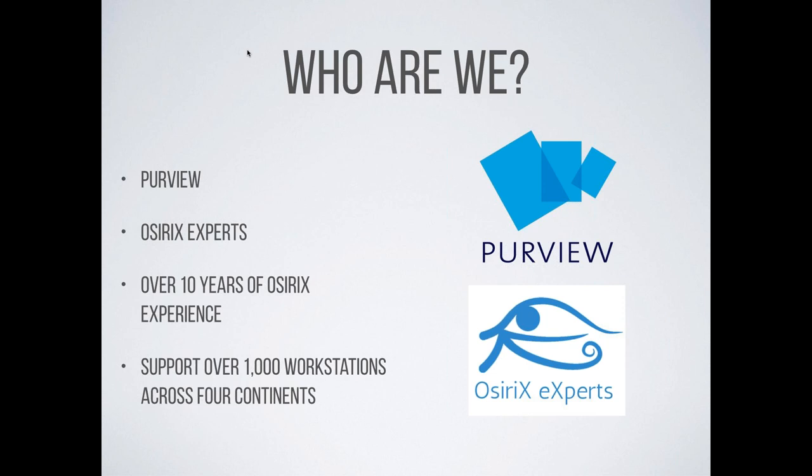Purview is at its essence a medical image management company. We've built tools in the cloud that exist on premise in healthcare organizations, small and large, to manage medical imaging. And over the past 10 years, we've built a business around supporting Osirix.